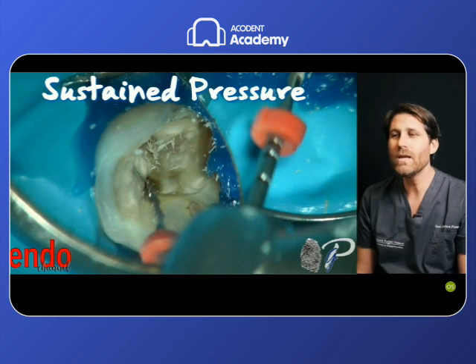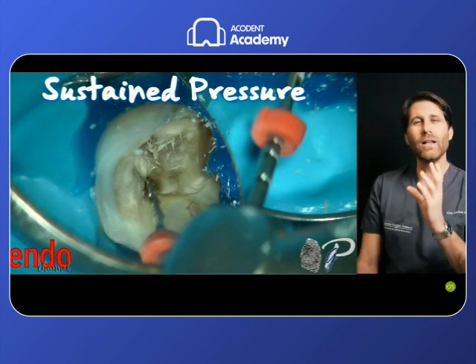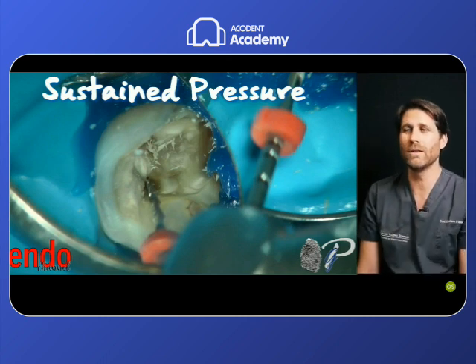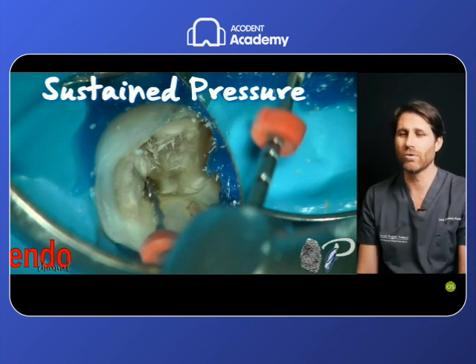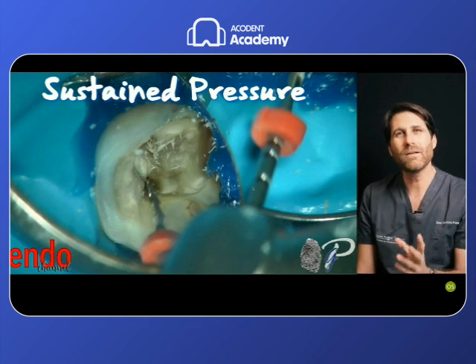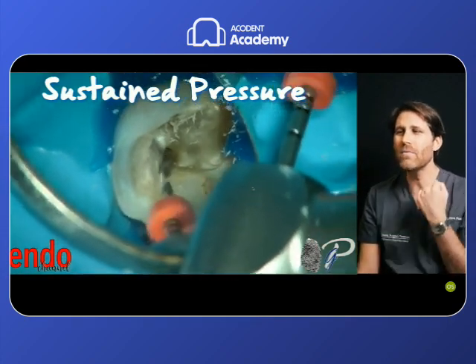That means that we do a manual scouting, we stop at a point. The secret is that we need to give the file the possibility to penetrate in a penetrable tissue, but we are not able to do it with the manual stainless steel file because it's too soft, it's guided by hand, it doesn't have the power to do it. So we measure this length, we put the rubber stop on the Reciproc file 1 millimeter more than this length. We insert it in the root canal and we start pushing 1 or 2 seconds maximum and go away.